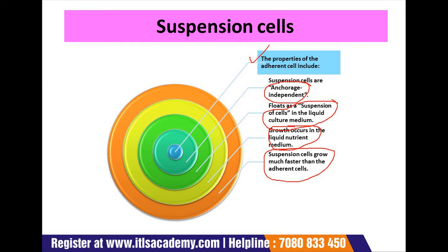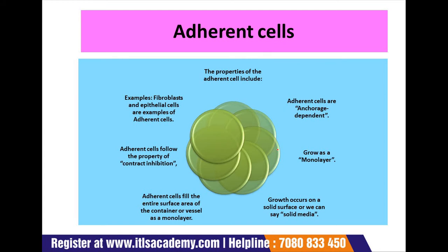And there is a short lag phase in suspension cells. Enzyme action is not required for the dissociation of the cells. This is the main thing. Now we will discuss the adherent cells.